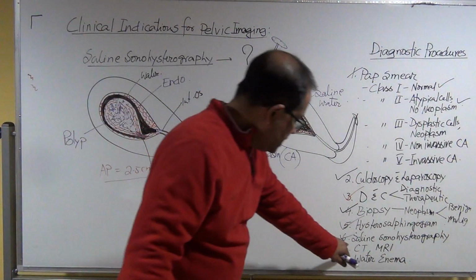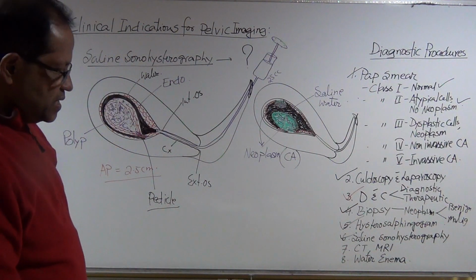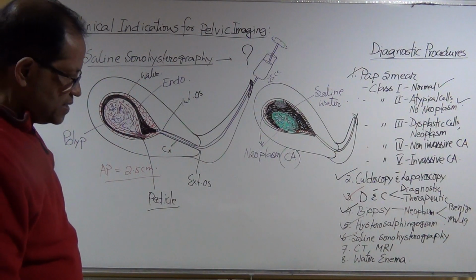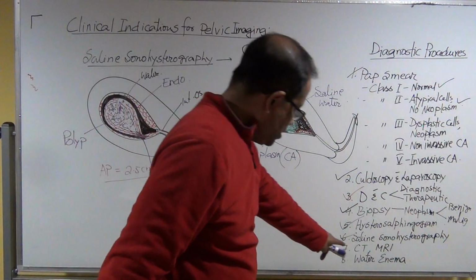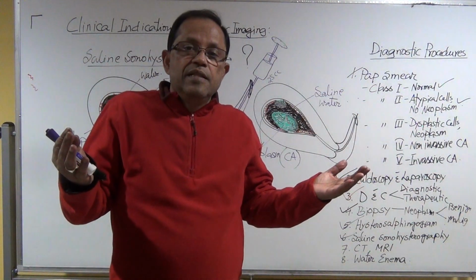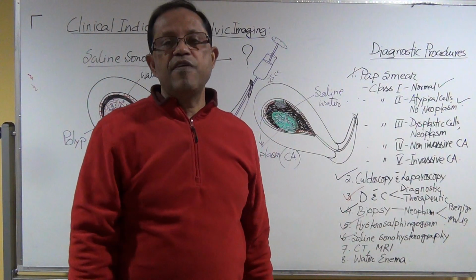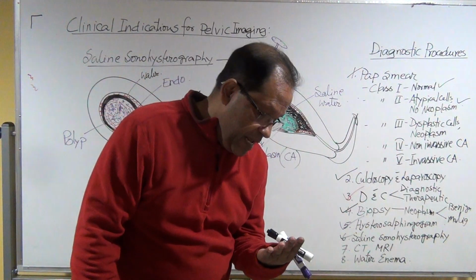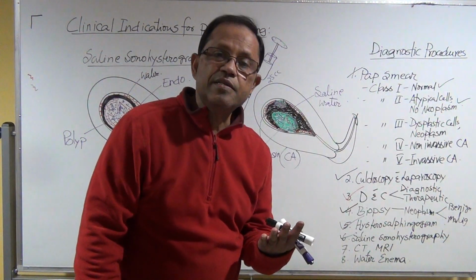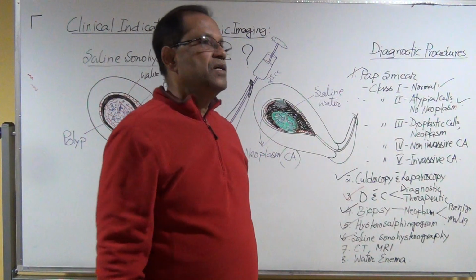The good thing is that you can compare the CT with the ultrasound findings and the MRI with ultrasound findings. If you see that the result of CT and MRI is in the patient's file, patient chart, you can compare your findings. You can read and understand what the patient's diagnosis is, and whether you are getting the correct things or not.